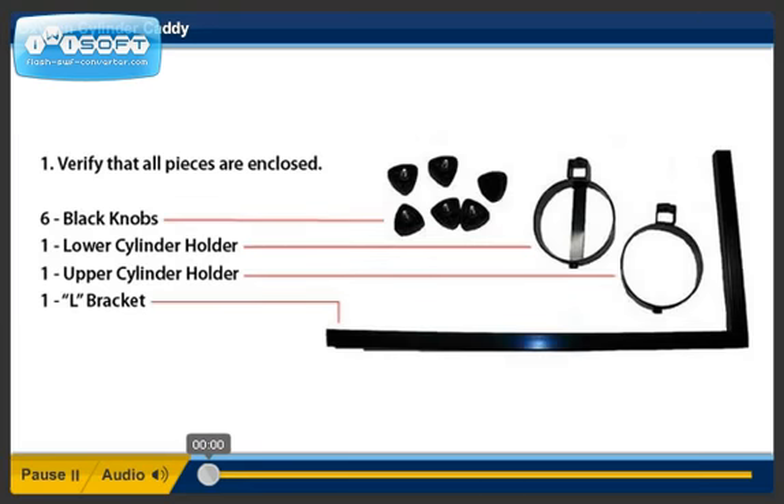Step 1. Verify that all the pieces are enclosed.